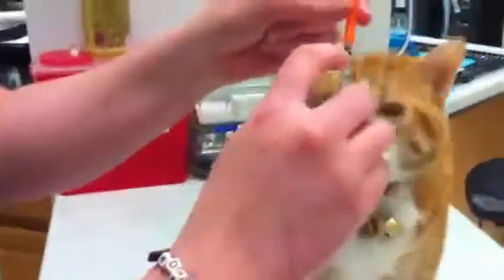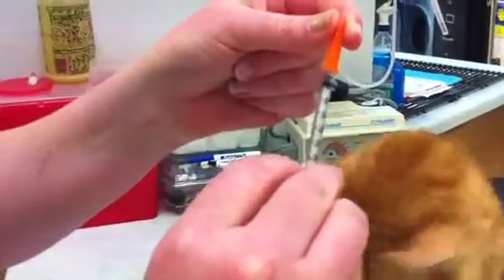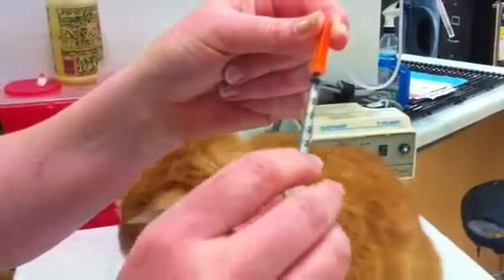There's a little bit of air in the top of the syringe. Just push that out to put your plunger to the top.